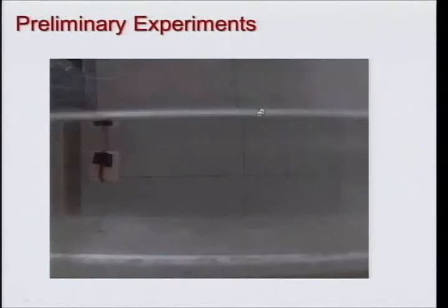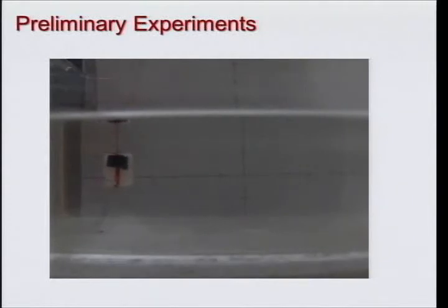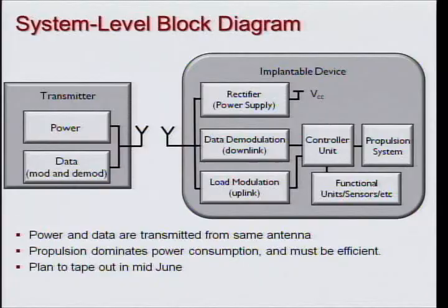To give you an idea, we have a video, I don't know if it works. Hopefully it will work. So you will see it is like kayaking, the paddle, the kayak is moving. Here it has a wire, so it doesn't fit my principle of wireless. So we are going to tape out tomorrow a chip where everything is wireless, the implant device. The chip is taping out tomorrow, and we are also putting up the test board.